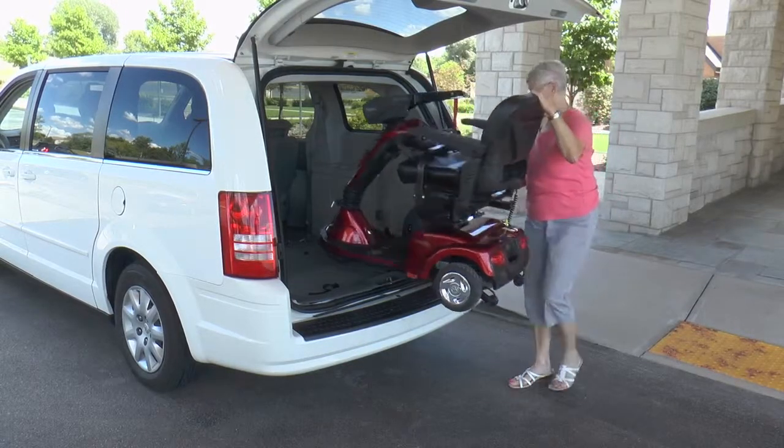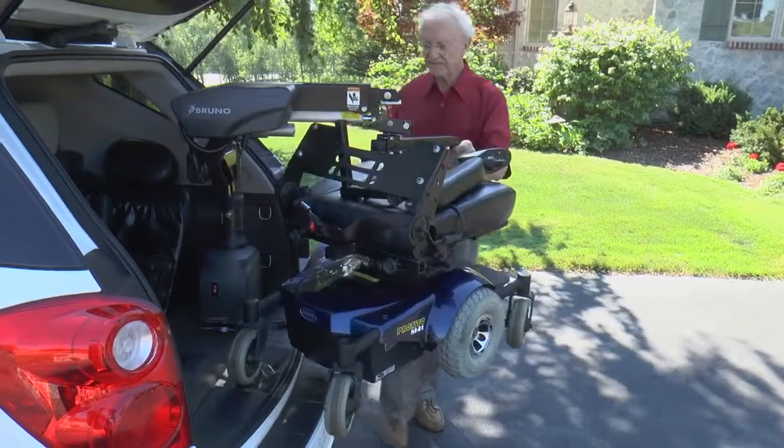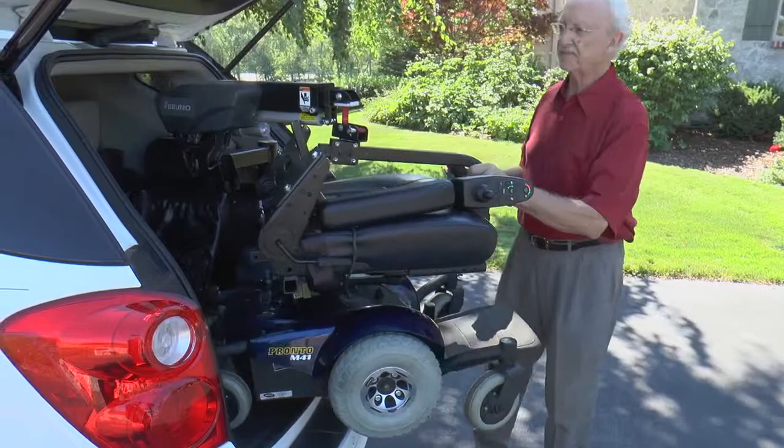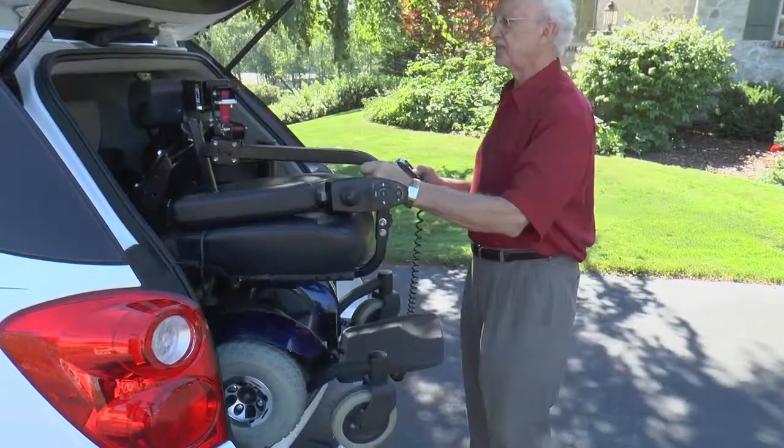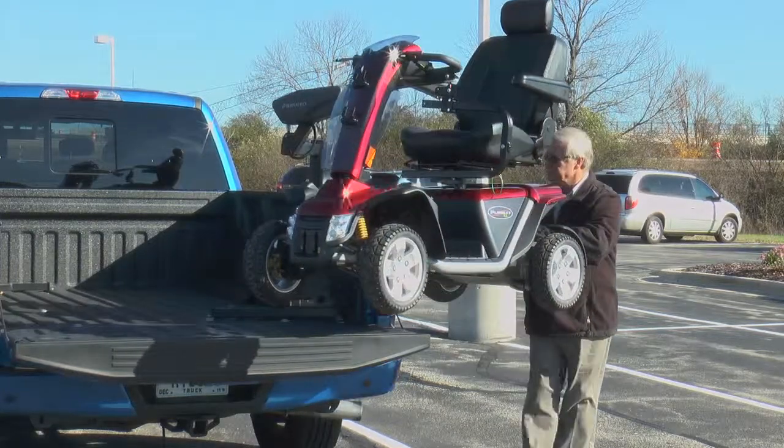Bruno's most popular interior lift, the Curbsider, power raises and rotates your mobility device inside an SUV, crossover, or van with ease. And the Curbsider is one of Bruno's most highly sought-after solutions for pickup trucks.